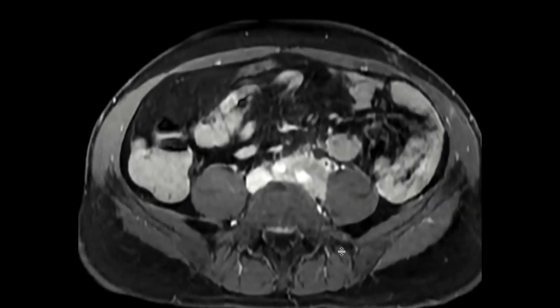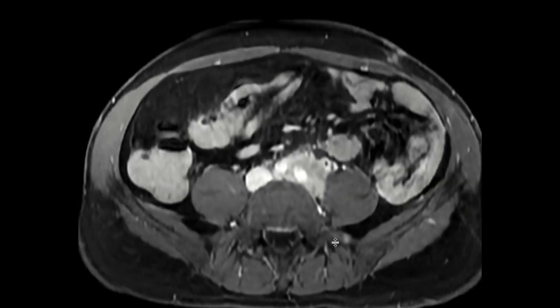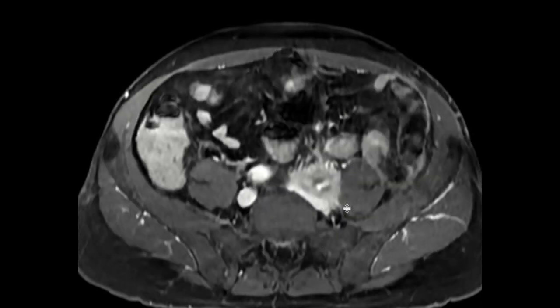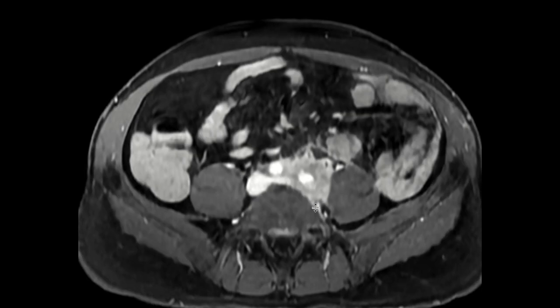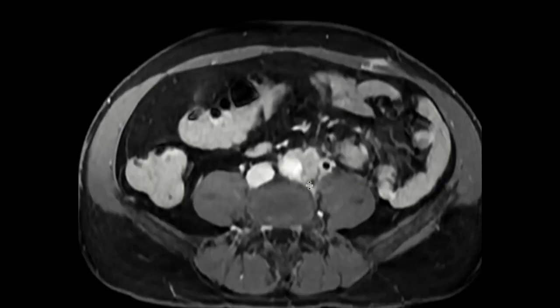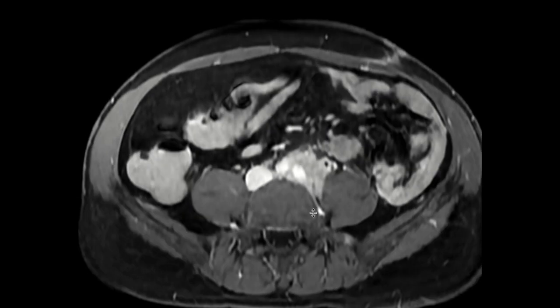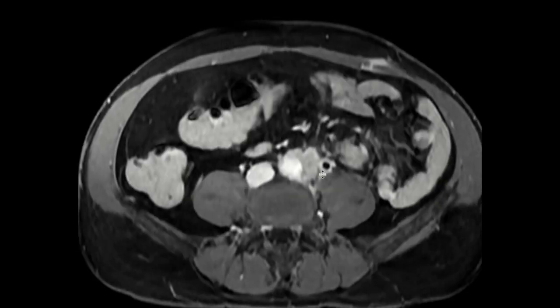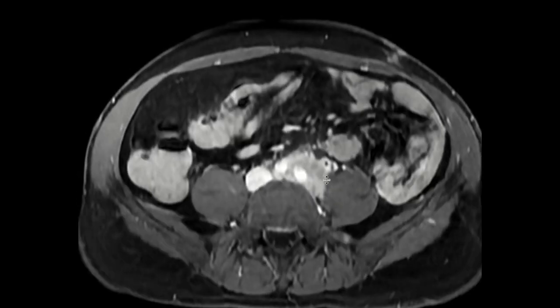Now here you can see the iliac bone right here. You can see a transverse process. You can see the sacrum coming here, and this is the bulk of the mass right here and a little higher up. And there's not really a good window to be able to come posteriorly to be able to target this mass. So the approach that we ended up using was to tilt the angle of the gantry so that we were able to come up from a higher position between the transverse processes, but actually aim the needle down inferiorly into the bulk of the mass. And I just wanted to show you what that looks like.